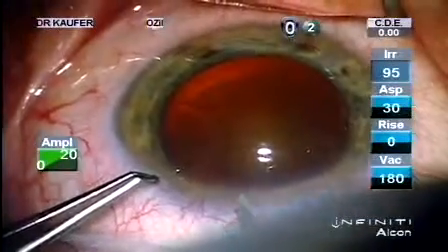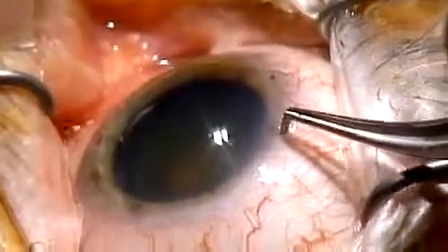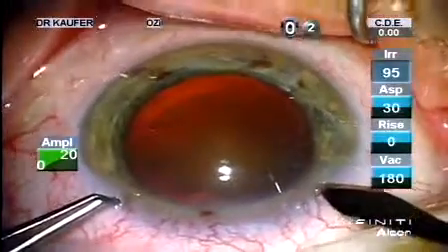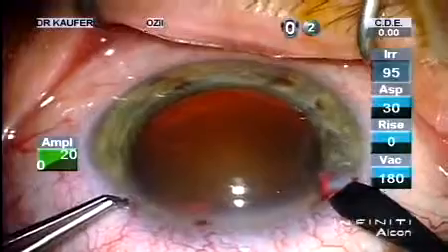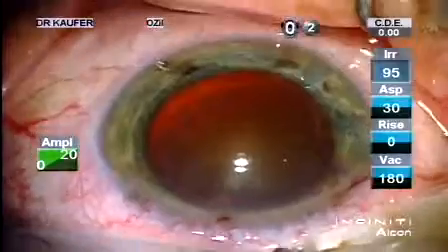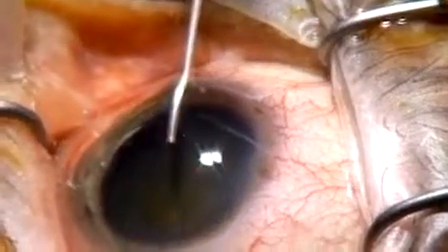Okay, so we start with our paracentesis. This is a 1.1 incision. Now we're going to make our little groove, and we're going to go in through the stroma and into the anterior chamber, creating a 2.2 millimeter incision. We're going to be using 100% Ozil. This is a very dense nucleus. Right now we're using Discovisc as our viscoelastic, deepening the chamber.